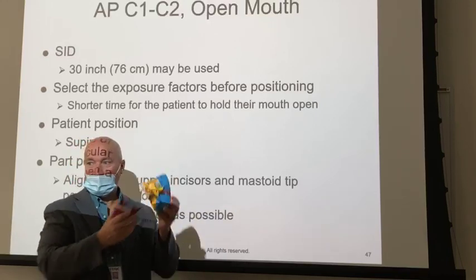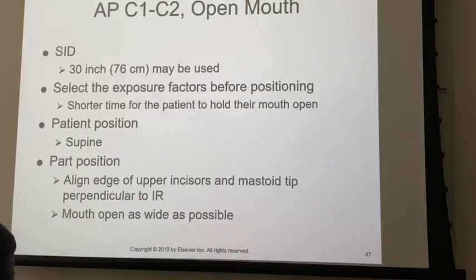Does that kind of make sense? What that is called is the Ottonello method. The Ottonello method is a way of using motion to see something that we otherwise wouldn't see.